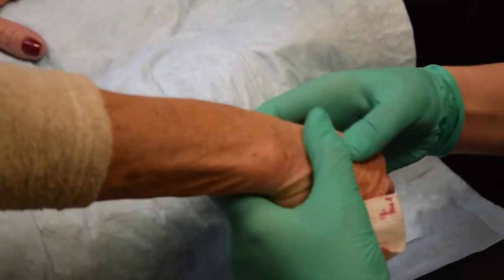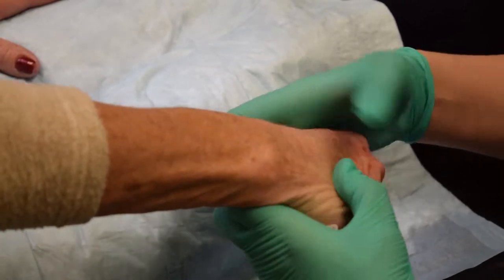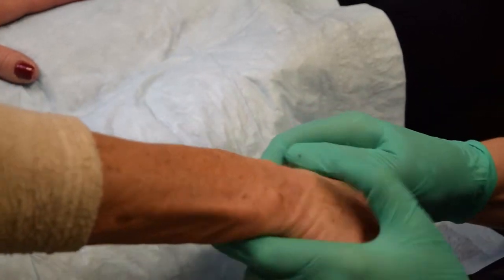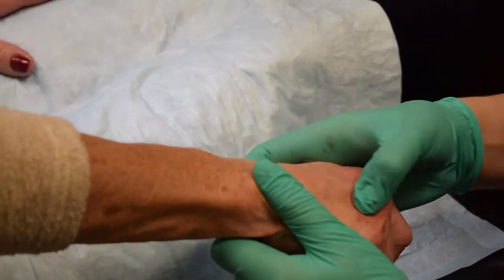The last step is thorough massaging of the boluses to create a smooth appearance. To facilitate massage, I used a few drops of chlorhexidine — you can use sterile lubricating gel instead. Once completed, sterile gauze will be placed over the hand and the patient will then sit on the hand to help smooth the material.